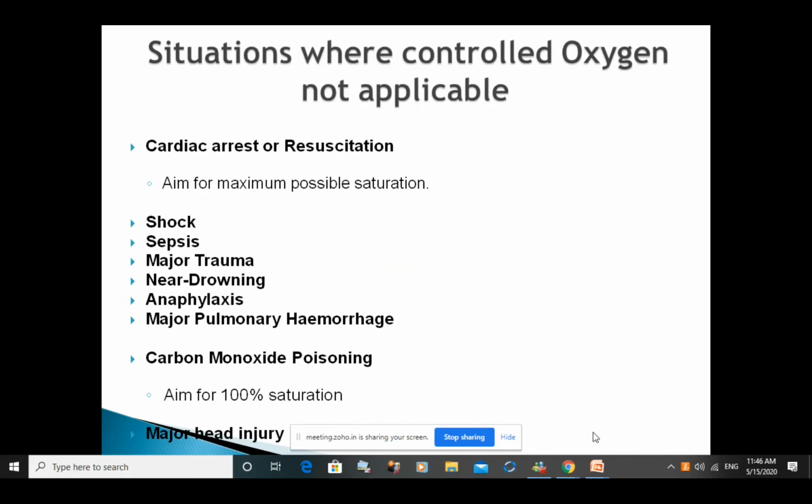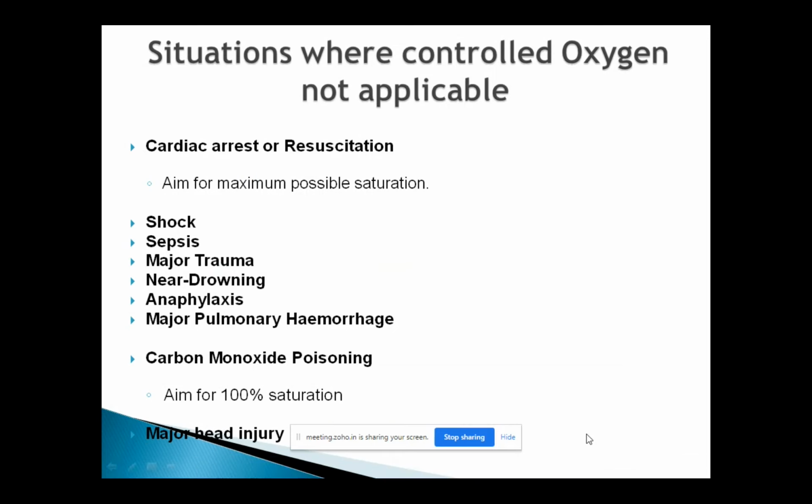Once they regain their consciousness level, once their clinical condition is stabilized, then we can downgrade them to the appropriate level of oxygen therapy. But until then, this is important to manage their hypoxemia properly. Right. A very common practice, even when I was a junior physio, what we did in India is humidification.